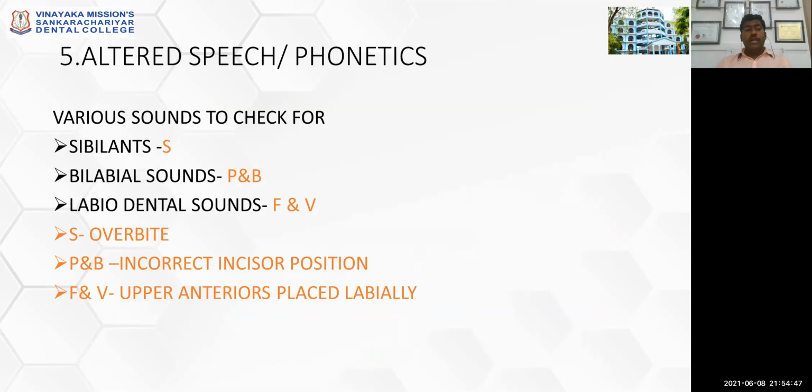Altered speech or phonetics. Another major complaint why the patient comes to you is that, doctor, I'm not able to converse properly, or when I'm conversing, I'm not able to put across this particular message to my friend or relative or somebody else. So I am not able to pronounce certain words, certain letters properly. When you are delivering this denture to the patient, it is imperative for you to check three different sounds: your sibilants, your bilabial sounds, and your labiodental sounds.